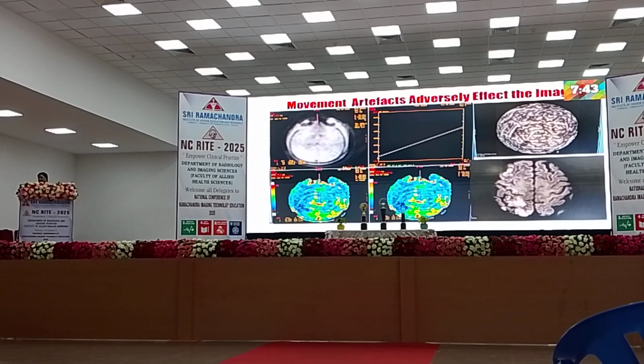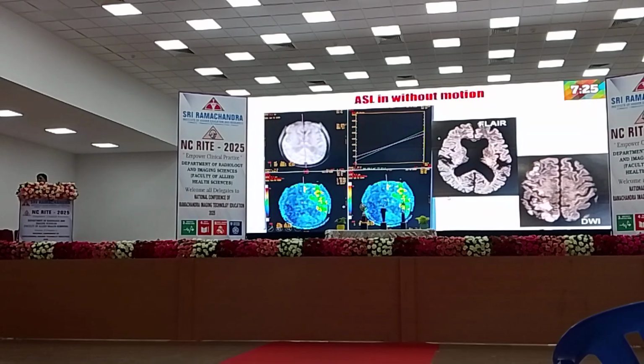This is very, very important. We are facing a lot of cases of restless patients in acute stroke. In restless patients, you should not do ASL because it will give an error. Here you can see a small infarct, and ASL shows bilateral hyperperfusion. With sedation, you can see here that the perfusion is normal. So always, in a restless patient, you should not do ASL.